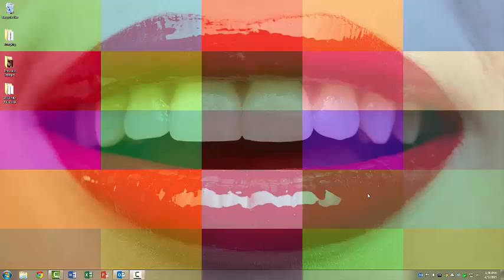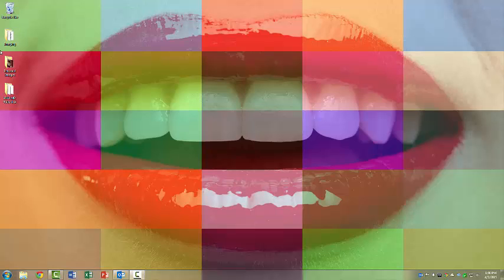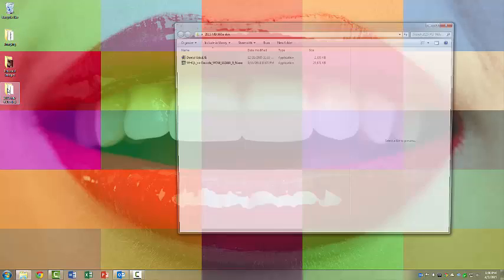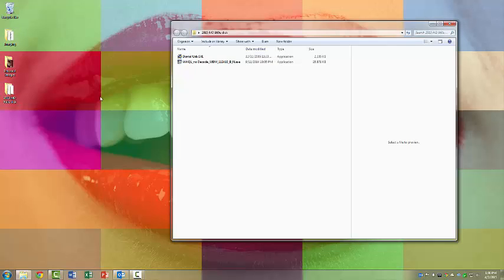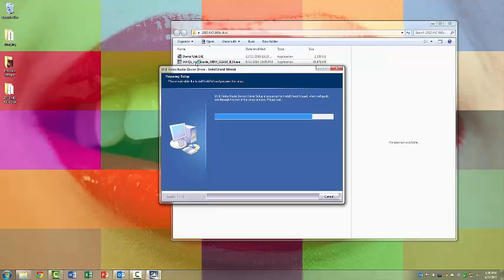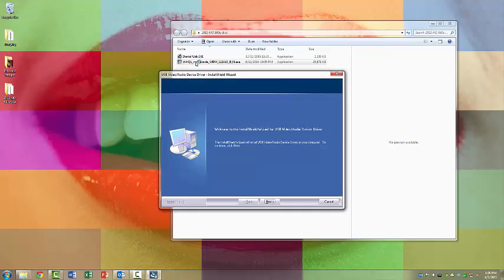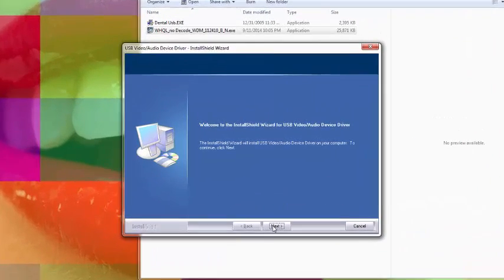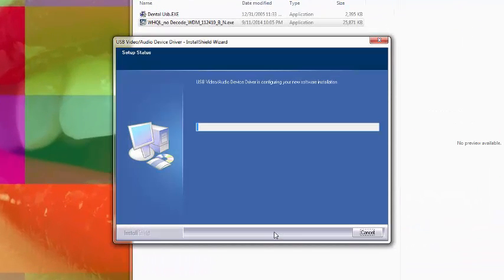So now you're going to double-click on the folder where you copied the files and select the driver to install. And you double-click on that to initiate it. Click Next. And the driver files will all install.